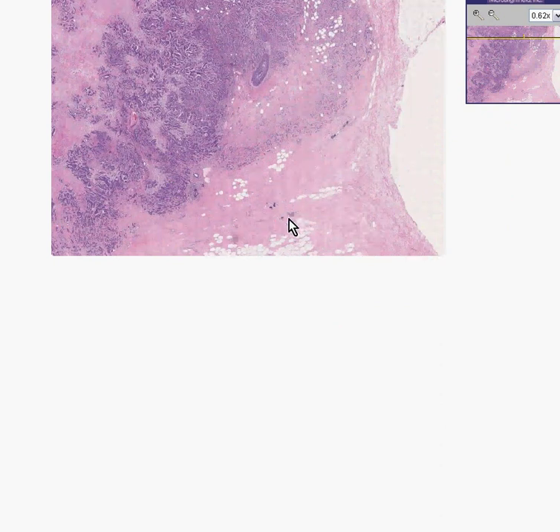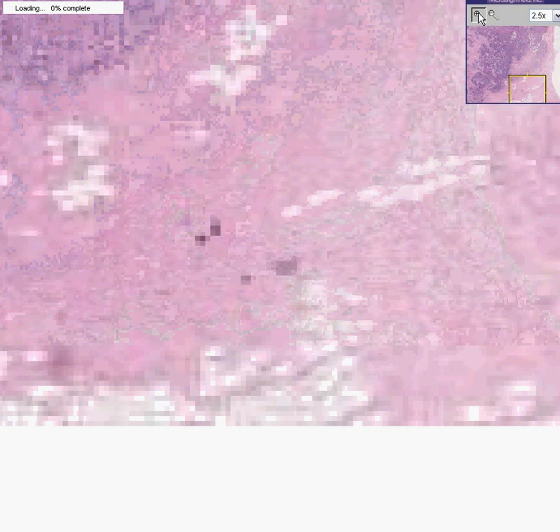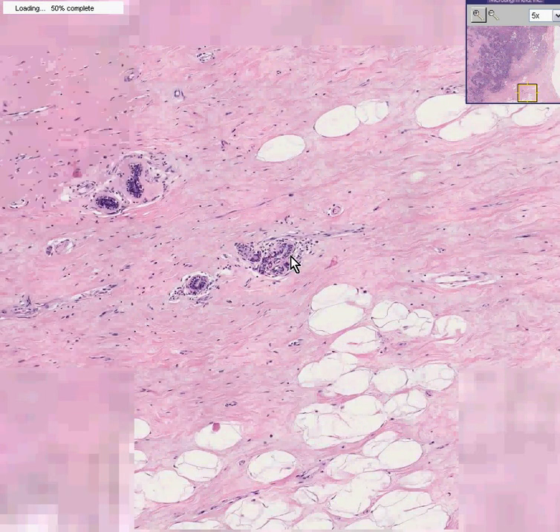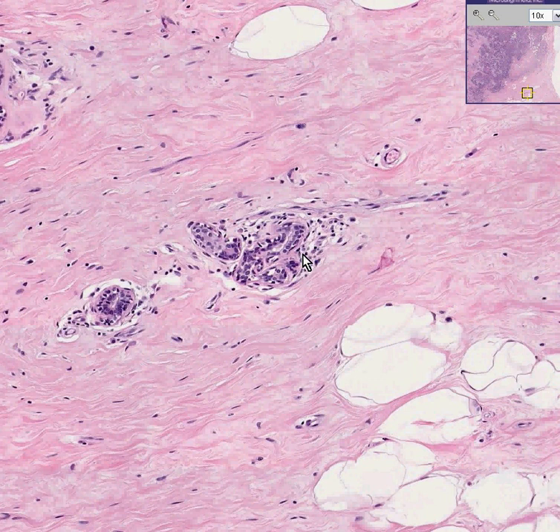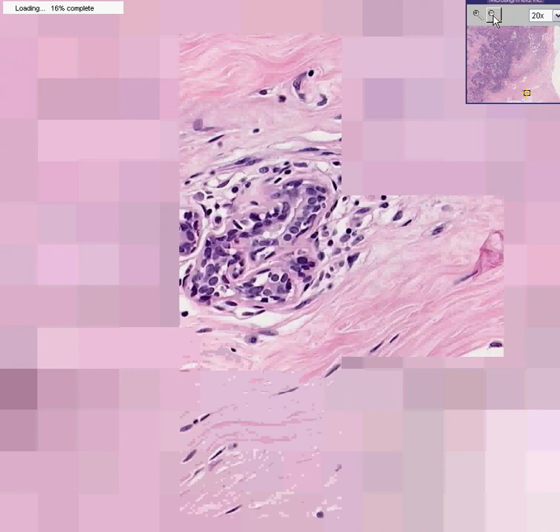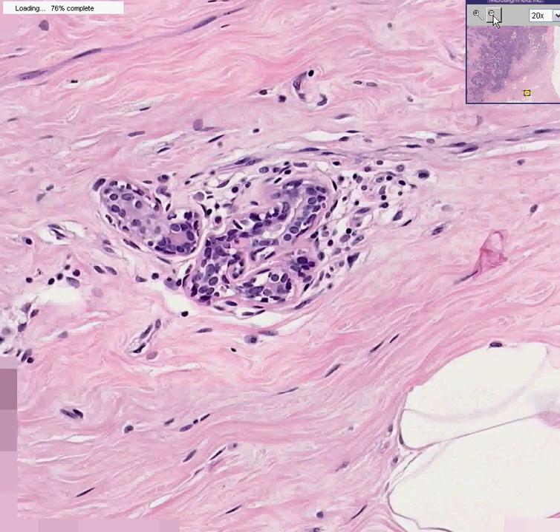If you look at this part of the breast for comparison, I think I could convince you this is probably a normal lobule, even though it's small, part of a normal lobule. You could see some acini. You could see how there's some looser connective tissue around it, and then it's surrounded by denser connective tissue and ultimately intermixed in with a lot of fat. And there's your classic textbook normal lobule at the highest power we're allowed to go.